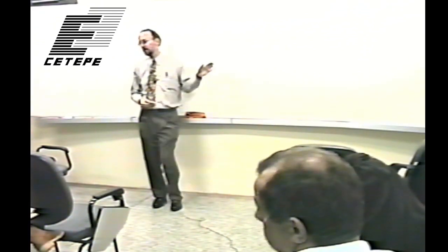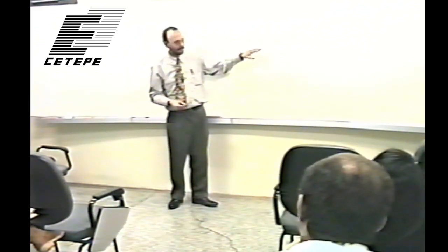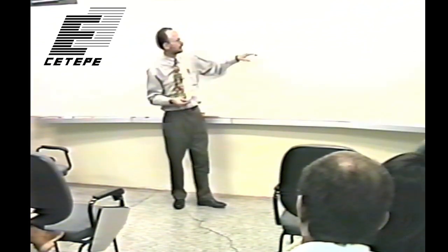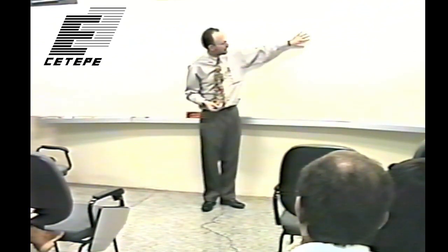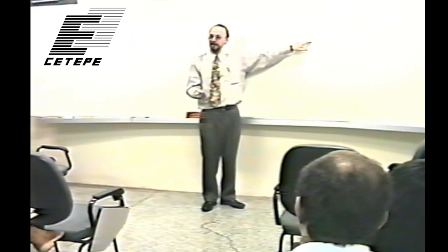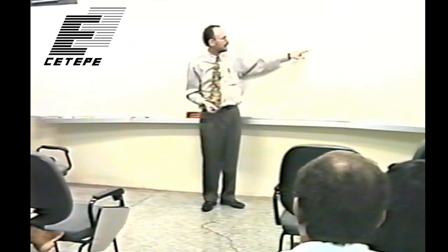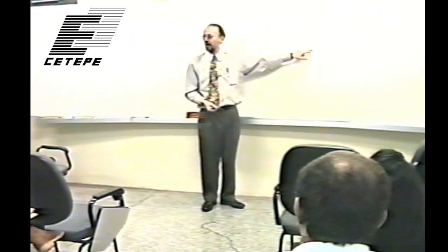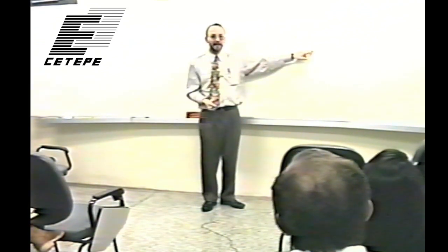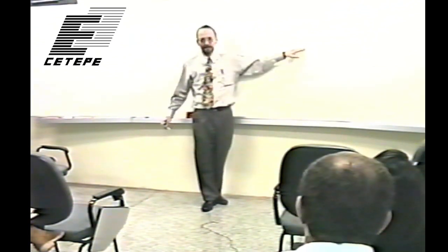There's a multi-billion-dollar market developing and selling these screens and film systems, and for every kind of exam there's going to be a different film screen system. You can have a thin front screen and a fine emulsion on the front to try to stop the low energy X-rays and give high frequency or fine detail into the image. And then the idea behind this one here is that it'll stop the higher energy X-rays and stop more X-rays and give the kind of low frequency gross variation of attenuation in the patient.